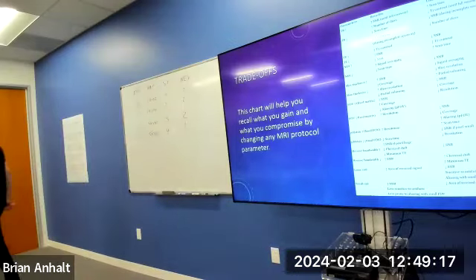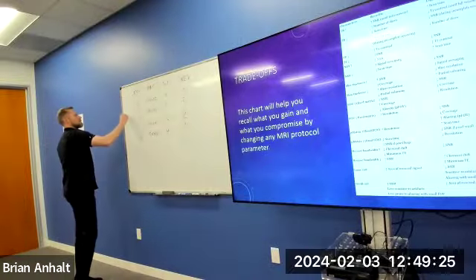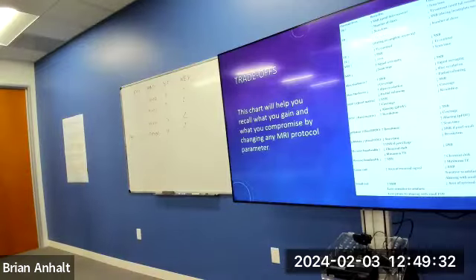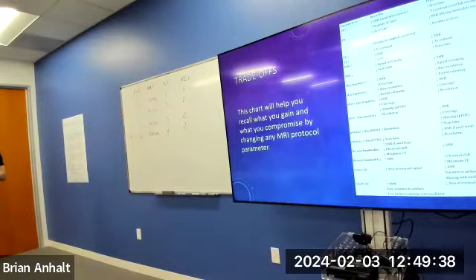Which one of those has the best SNR? We got 1, 2, 3, 4. What am I looking for? NEX doesn't tell me anything, it's all the same, right? I'm looking for voxel size. I'm looking for the biggest or smallest voxel for SNR.